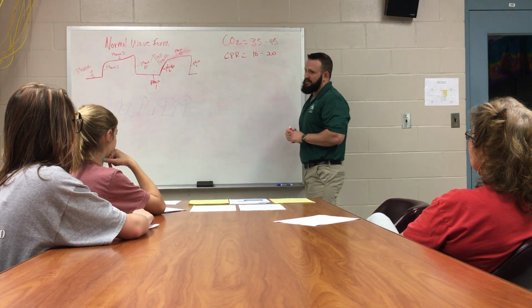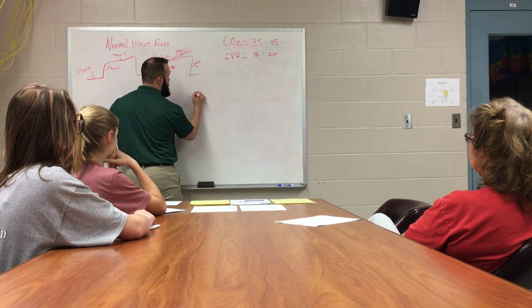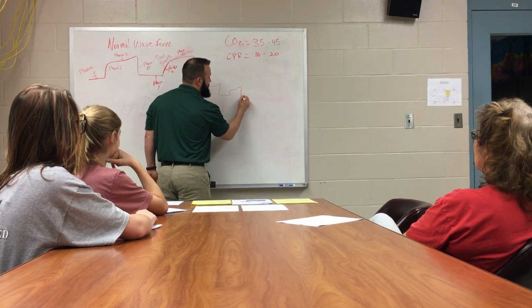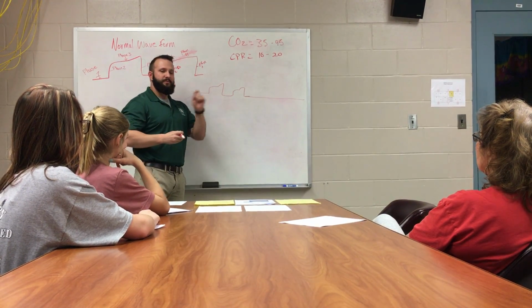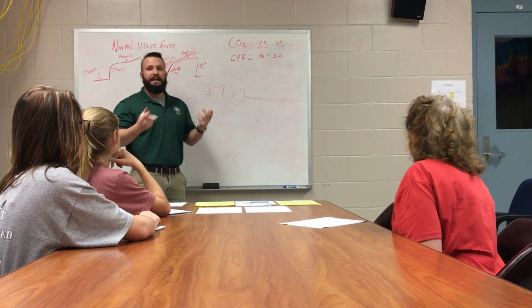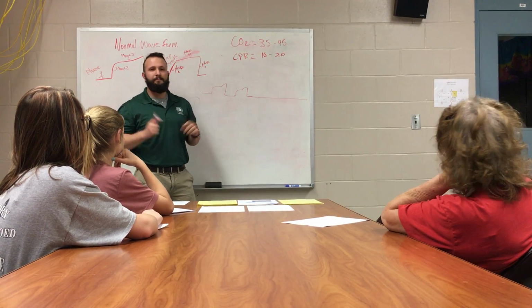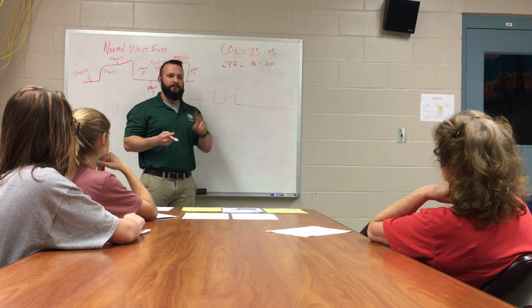Not with CO2 detection. If I have an end-tidal CO2 detection, I have my normal waveforms. Well, kind of normal. I can't draw. So we're normal, and then all of a sudden, I go flat. Well, the reason I go flat is because my patient has just dislodged their tube. Somebody has dislodged their tube. He may have coughed. There may be some kind of malfunction. But I know the tube is no longer in the lungs because where else in the body can I have CO2 exchange? Nowhere.